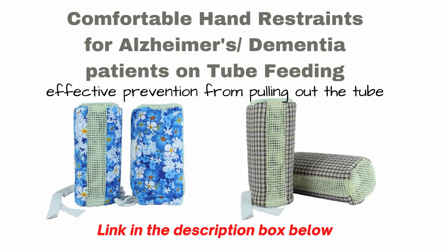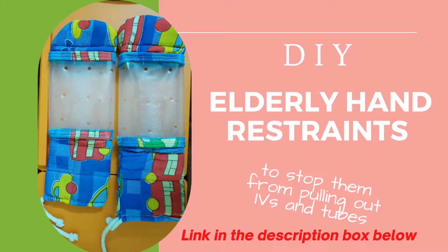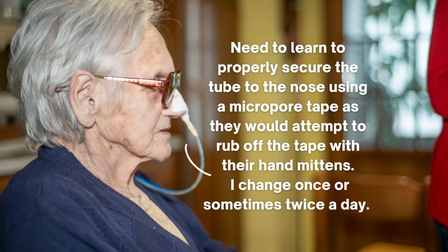Even with the mittens, she will try to brush against her nose, because the tube causes a bit of irritation and an uncomfortable feeling. So of course, naturally she will try to rub it off. I also learned to find a way to properly secure her tape. I change it almost daily to make sure that the tape doesn't come off easily. Also, in the last two months I actually replaced the plastic tube the hospital gave by default.